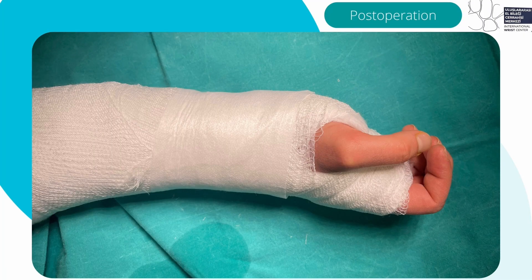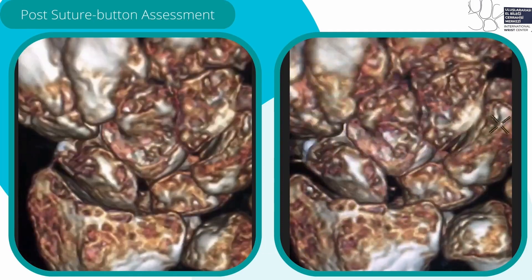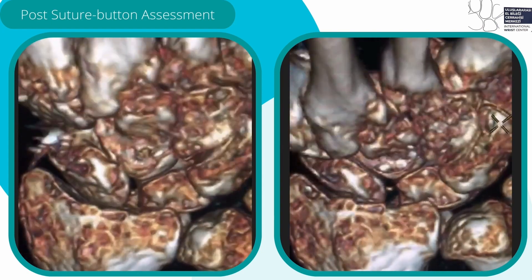Postoperatively, we apply a cast for 3 weeks followed by 3 weeks of splint. This is the final radiograph image postoperative. This is the dynamic 4D assessment postoperative showing restoration of SL dissociation.